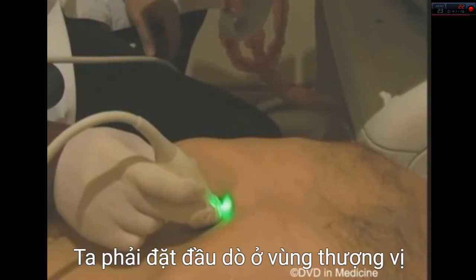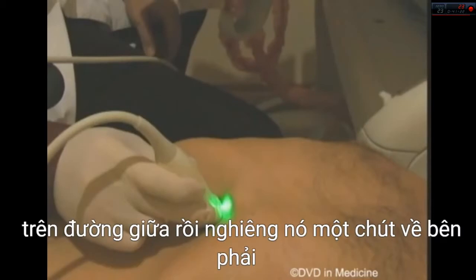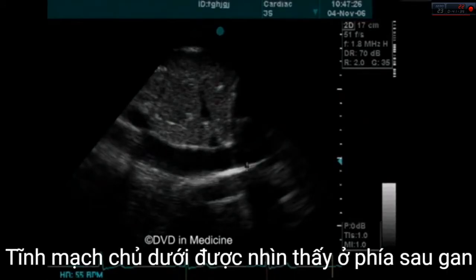One should place the transducer in the epigastric region and angle the scanning plane sagittally on the middle line and then tilt it a little to the right. Inferior vena cava is seen posteriorly to the liver.